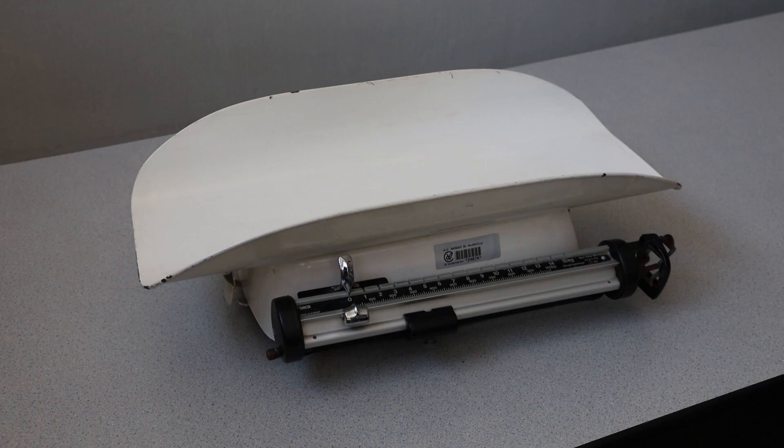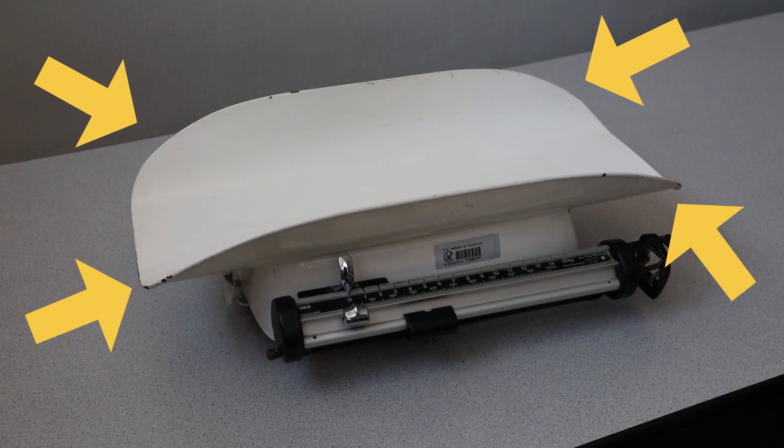The basic parts of an infant scale are the following. The basket used to place the infant in when weighing. The basket is curved or has protection to prevent the infant from falling out of the device and being injured.